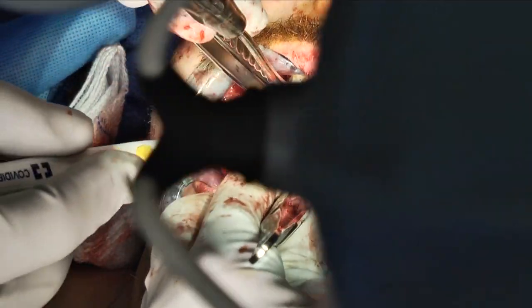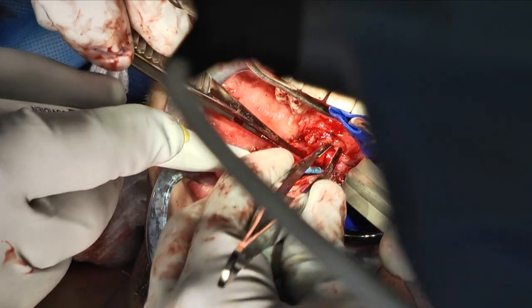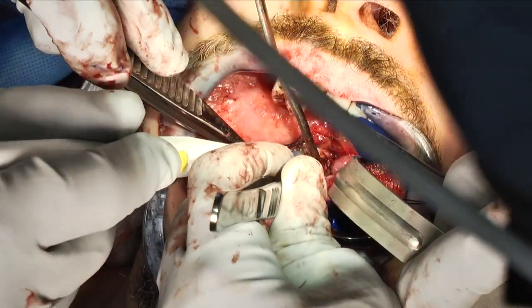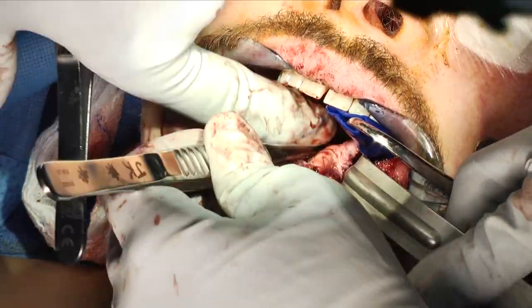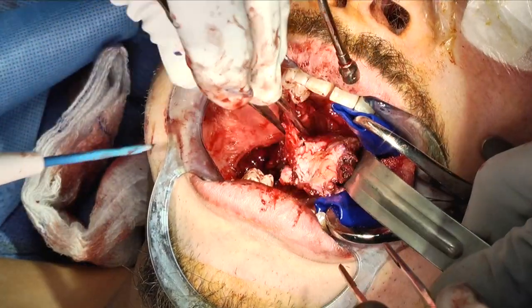This is a young patient with a squamous cell carcinoma of the right lateral tongue that extends back to the glossotonsular sulcus. Visualization of this particular cancer in this video is difficult secondary to its location, even for the surgeons. Keys to success here are negative margin status, exposure, and in instances where you are unable to visualize the extent of the entire tumor, a lip split mandibulotomy can be utilized.